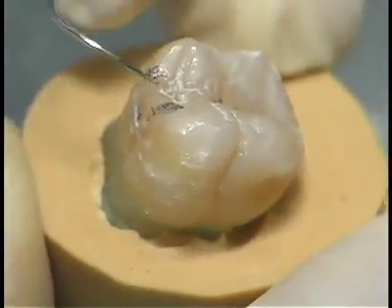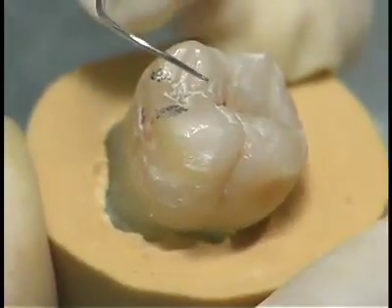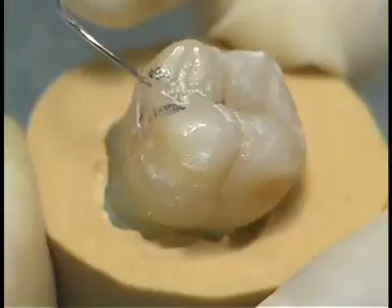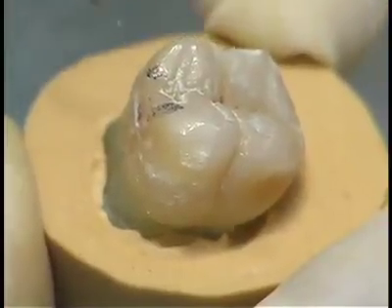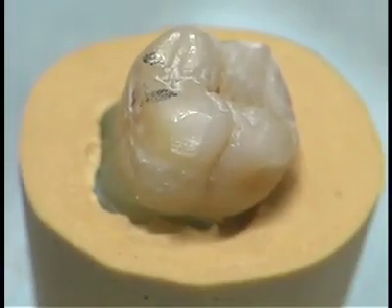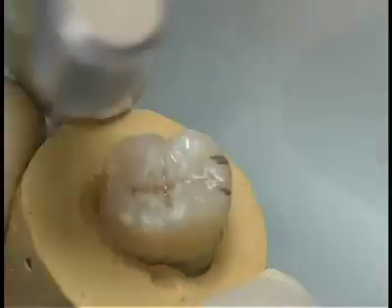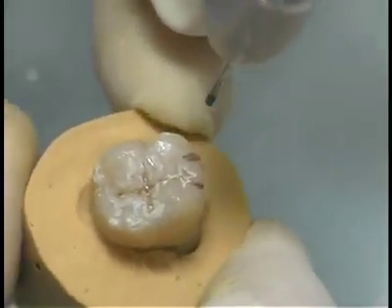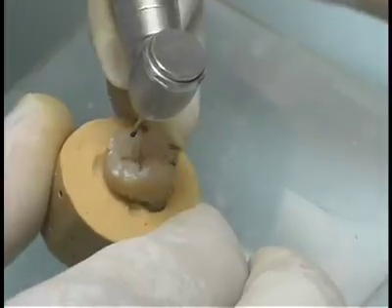The mark on the marginal ridge of the tooth structure indicates contact with the adjacent tooth. Before placing the rubber dam, mark the centric stops using articulating paper and tap the teeth together into centric occlusion. The blue markings left by the maxillary lingual cusp are supporting contacts of occlusion and should be noted prior to establishing cavity outline form.